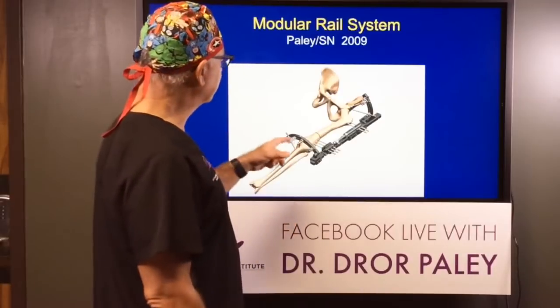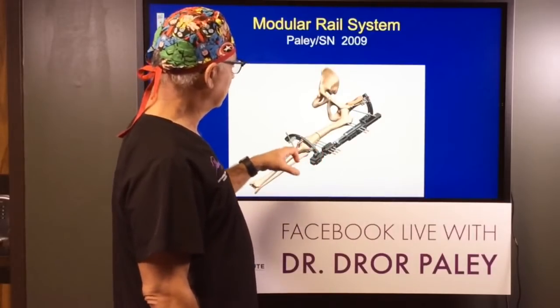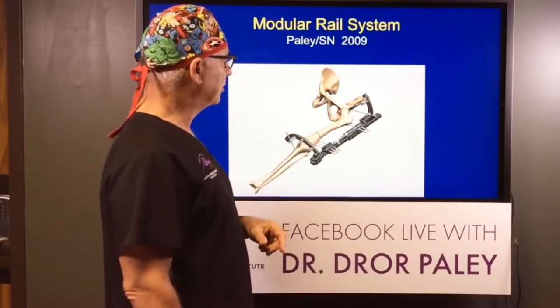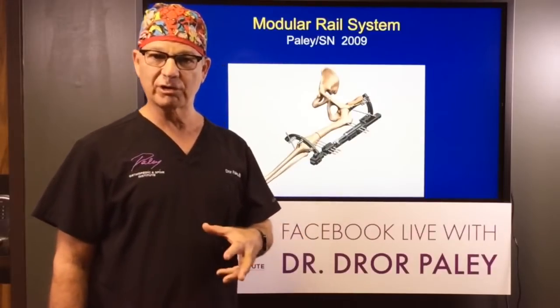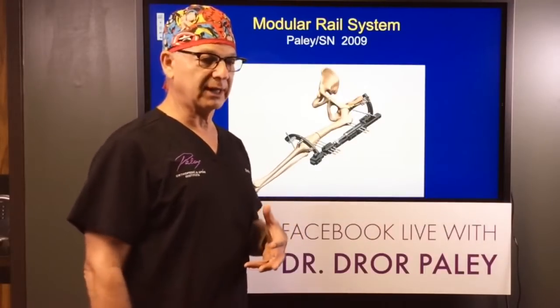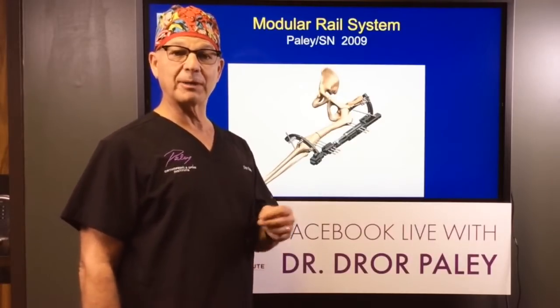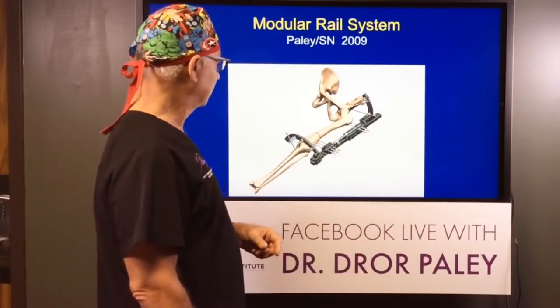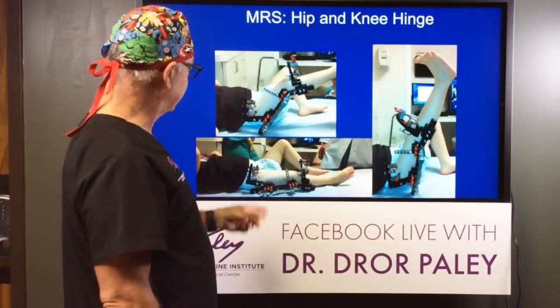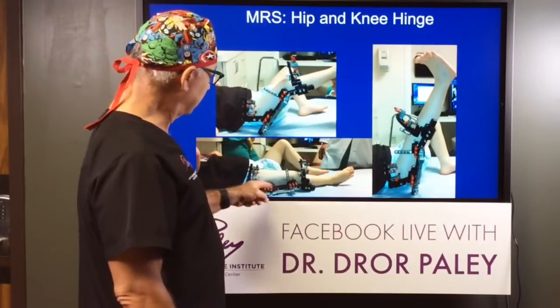The beauty of this device is that it could go across joints. So you could have a hinge at the knee, so it would allow the knee to move, hinge across the hip, allow the hip to move, and it would protect the joints from pressure. It would protect the joints from dislocating, which especially in kids with congenital femoral deficiency, who are born with unstable joints, we could stabilize the joint while lengthening the bone. So this was a big advance. And then, this is just an example of one such kid. You can see how he can bend his knee while he's lengthening. They're turning this screw-like device on the side in order to lengthen.